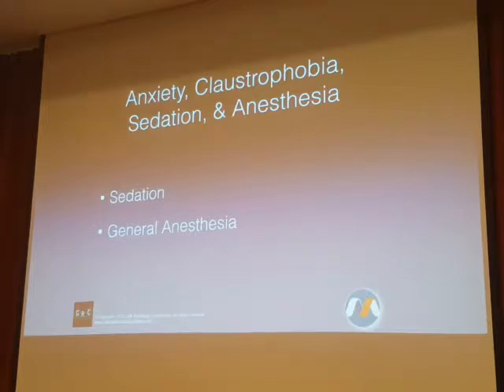I'm of the opinion that if you come to my house, number one, you are my guest. I will do everything I can to make you feel comfortable. But number two, you are in my house. You play by my rules. When anesthesia comes to your house, anesthesia should play by your rules. You wouldn't go to the OR and start telling the anesthesiologist that, really, you have this set at 6. I think it would be much better if you set it at 4.